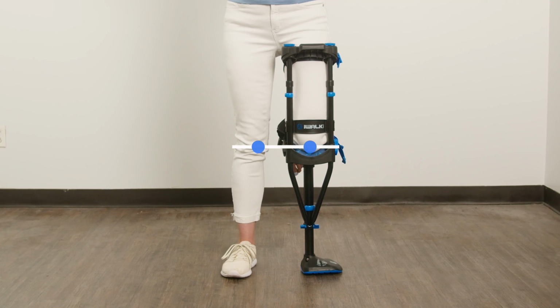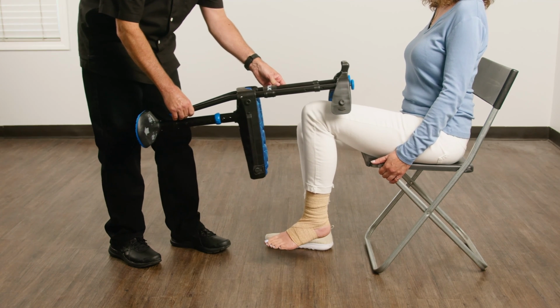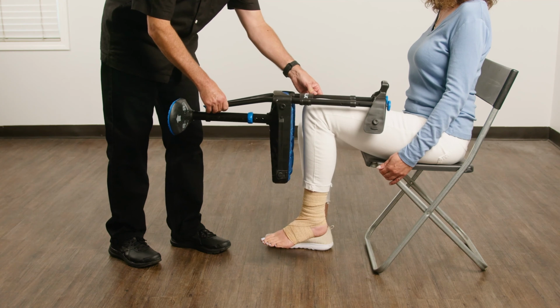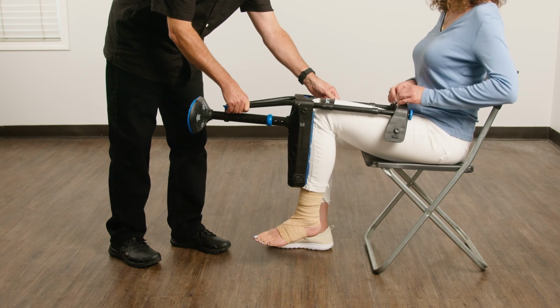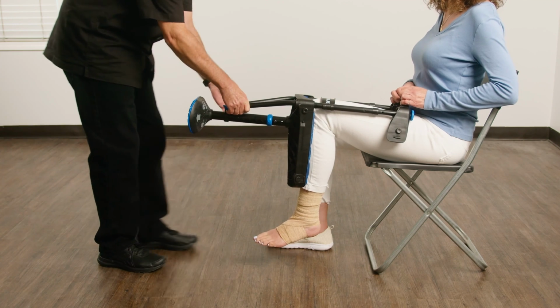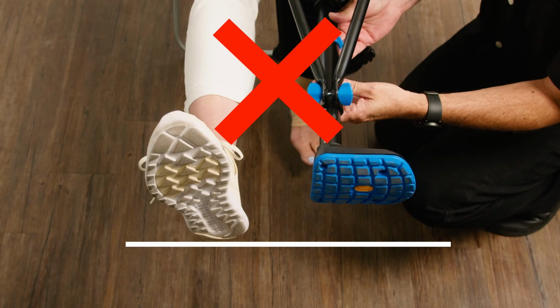Height adjustment, lower leg. When properly adjusted, the iWALK leg will be the same length as the good leg. To adjust the lower leg height, have the patient seated with their injured leg bent 90 degrees at the knee. Place the iWALK on the thigh of the patient so that the knee platform is pulled firmly against their shin. Have the patient hold the crutch in this position. Have the patient extend their good leg so that it's next to the iWALK.